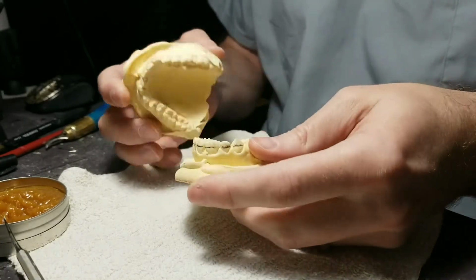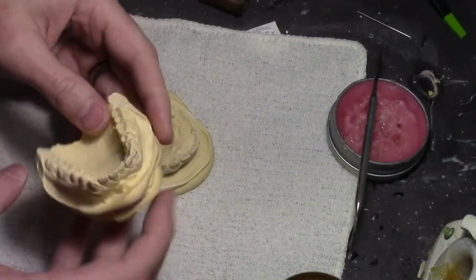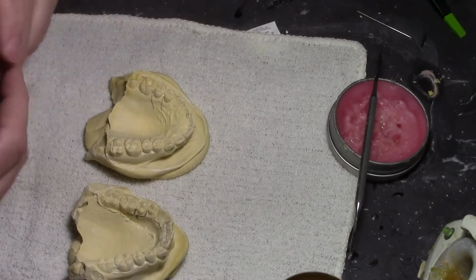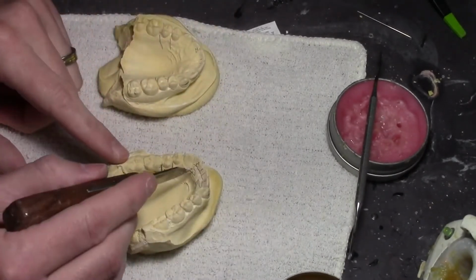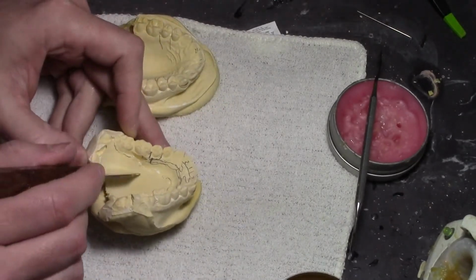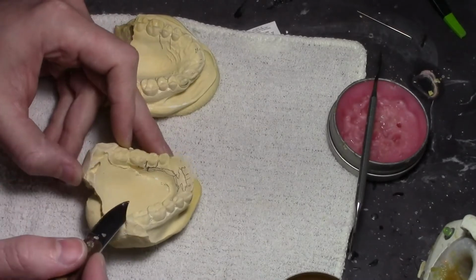I'm thinking the spring aligners are going to have to be maybe super spring aligners. I've already drawn one out here, as you can see. So I've already prepped it. I've got a little work to do here.